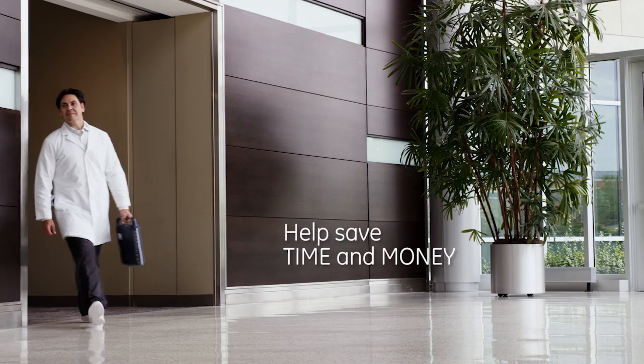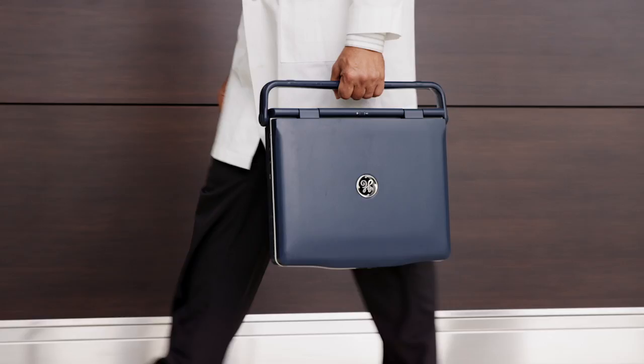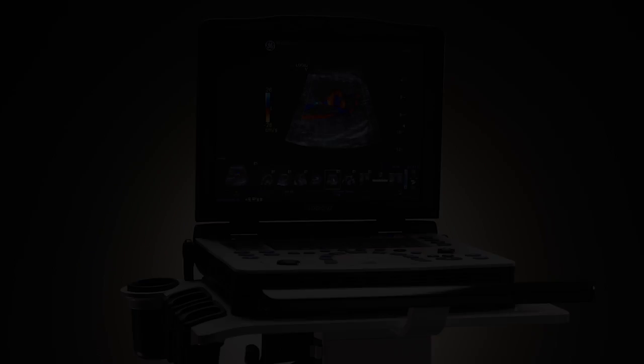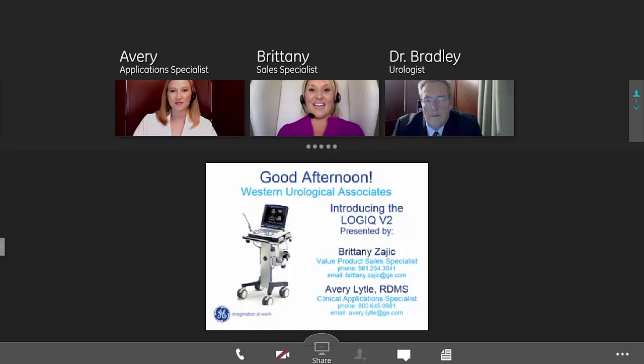Introducing a new technology to help save you time and money when purchasing a new ultrasound. Dr. Bradley from Western Urological Associates is looking to expand his practice and is participating in an online product introduction for the new Logic V2 portable ultrasound, with Application Specialist Avery and Sales Specialist Brittany.